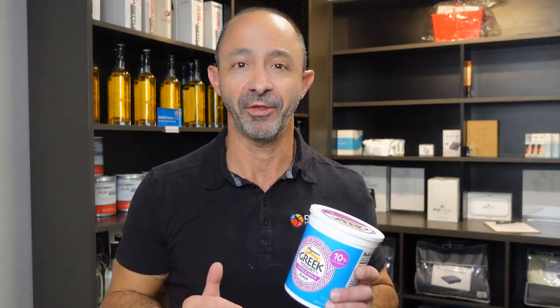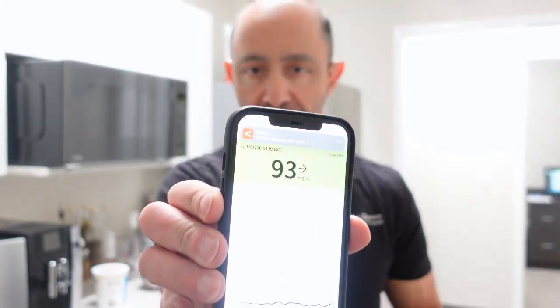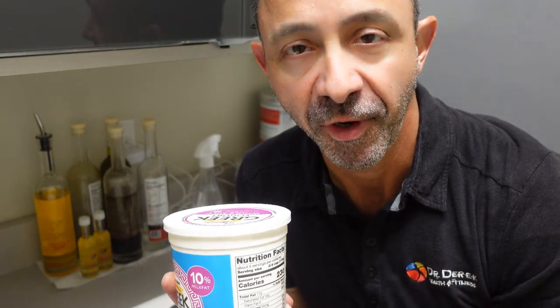Yes, that is right. And let me say that again. When something is higher in fat, generally speaking, it is considerably lower in sugar as long as there's not a sweetener added. So I'm going to put this to the test against my blood glucose level and let's see what happens. Right now I want to get a baseline blood glucose level. This is what it is prior to eating the Greek yogurt. Using my Levels Libre monitor, just going to touch it right up, and I am 93.